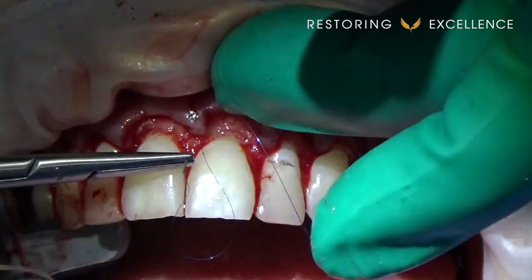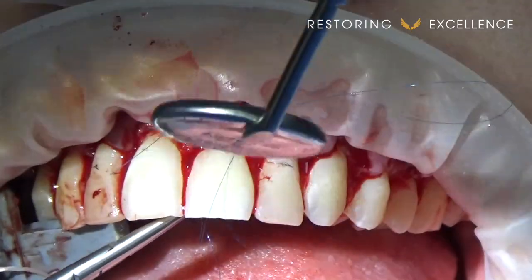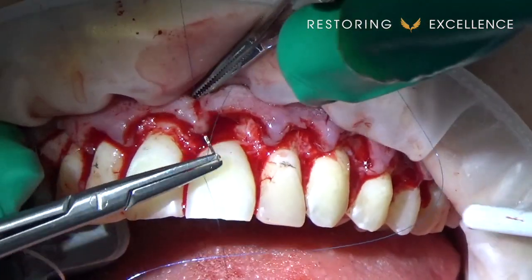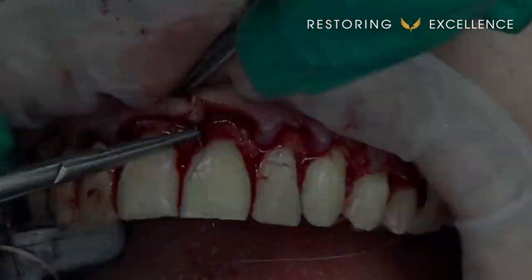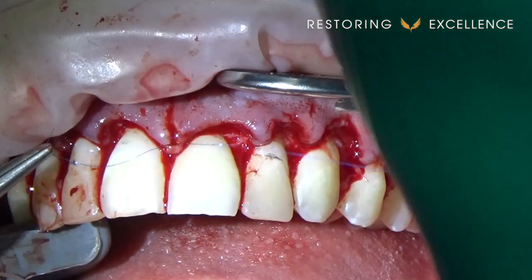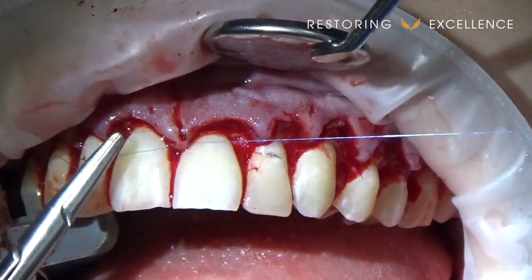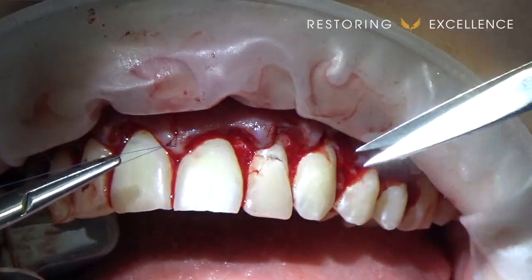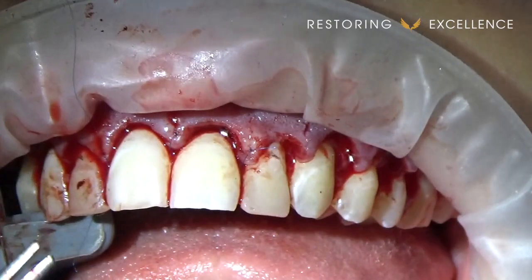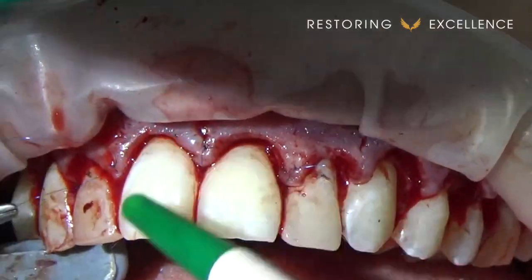Then we're doing vertical mattress sutures through each papilla. This is not a case where we're trying to bring the tissue down — we're not trying to cover a recession here — so just simple vertical mattress sutures on each papilla.